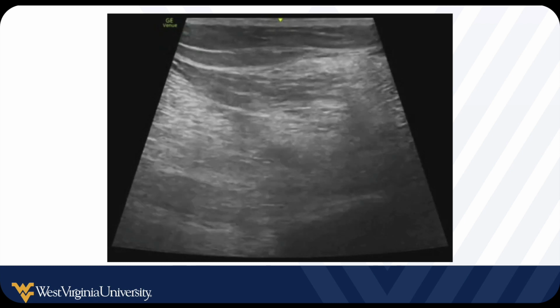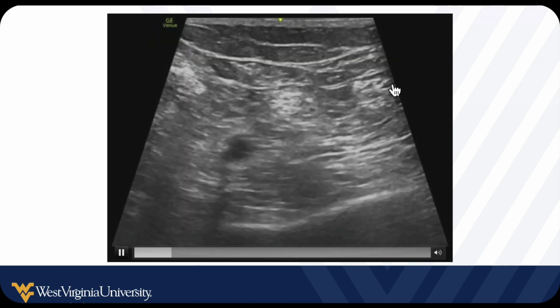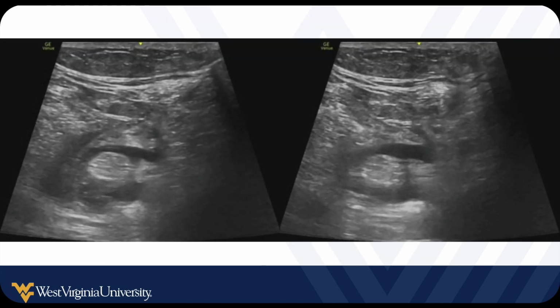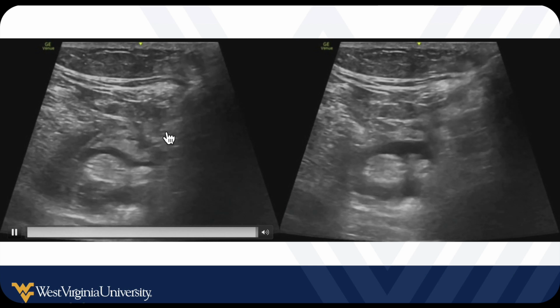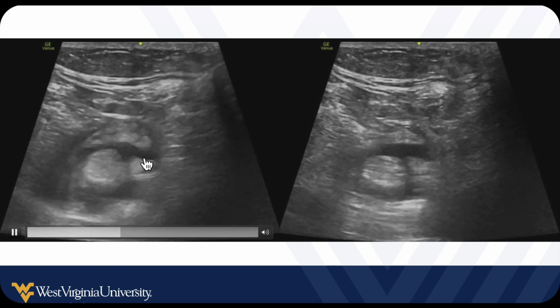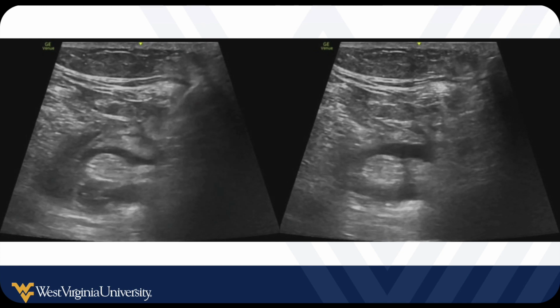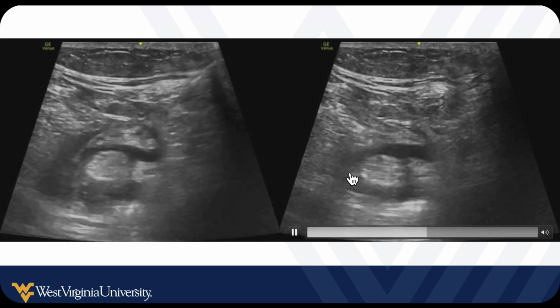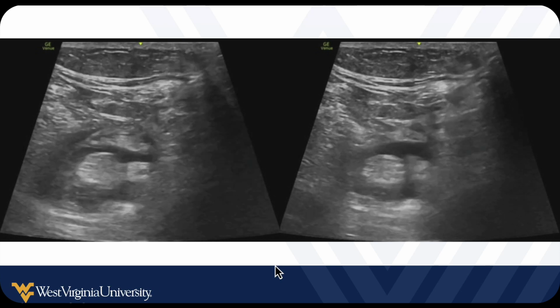So what we like to do is track proximally until we're at the sciatic nerve, and that's where we want to do our injection. And the nice thing about that is also it kind of moves you away from the artery and decreases the risk of hitting into that. And here's an example of what that will look like. So we've tracked proximally. Now we can still see a little separation in tibial and fibular nerve, but we're bringing our needle down and we're surrounding both of those, or if we get the whole sciatic nerve all in one nice bundle, we're trying to surround that completely, but this is what it looks like. Needle comes towards, and you see here we've surrounded that complex with local anesthetic, and just another nice little image of that here.